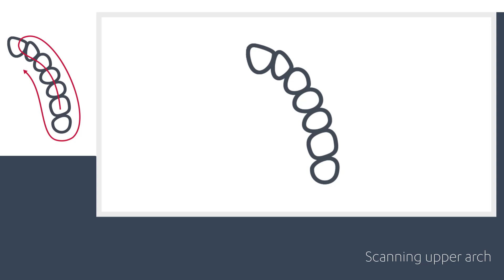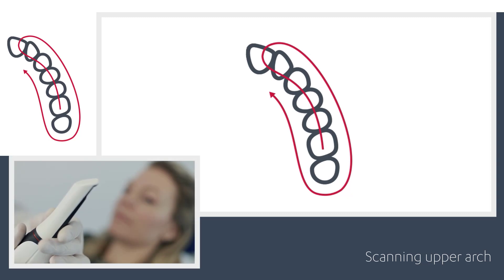The recommended scanning path for the upper arch consists of three swipes — occlusal, buccal, and palatal — to ensure good data coverage of all surfaces.